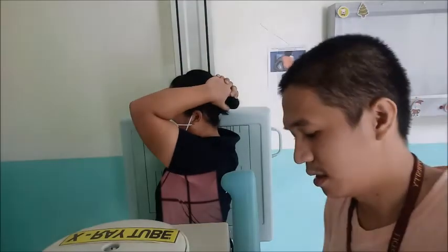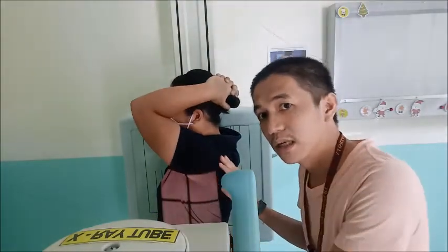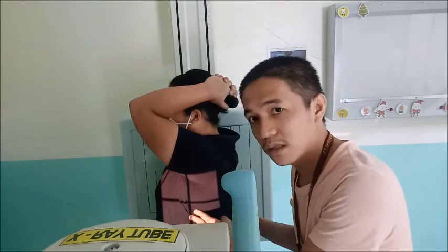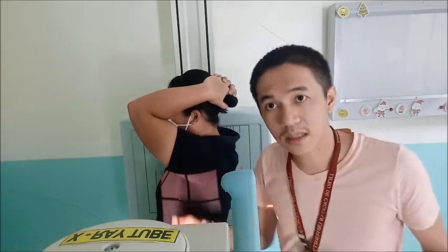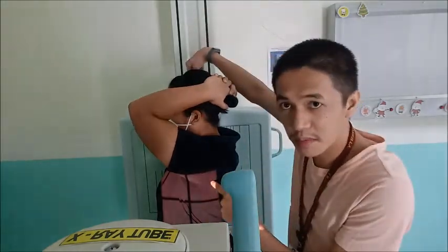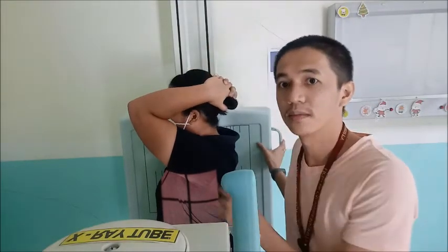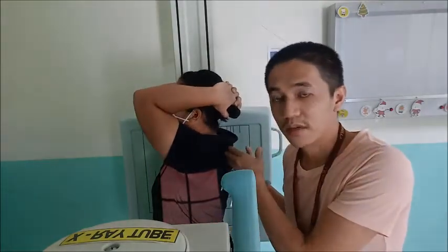Okay? So, the center sa atong crosshair, vertical and then horizontal. Kaning vertical should be at the MSP of the patient. So that means the MSP of the patient is center sa atong crosshair, and at the same time center pud sa baba, at the same time center pud sa atong IR. Okay, so that means the structure is at the center of the cassette.